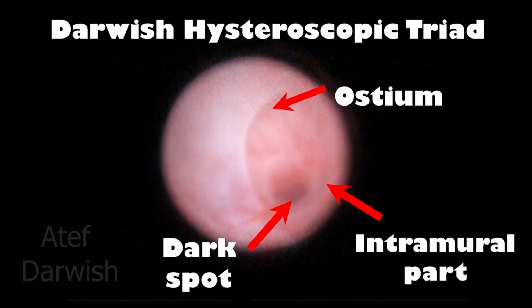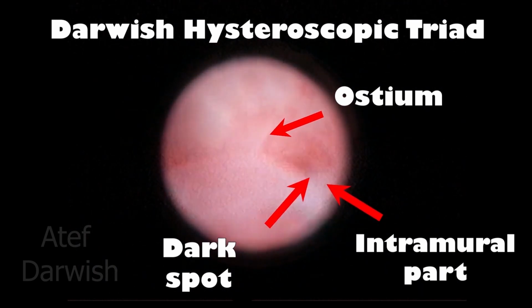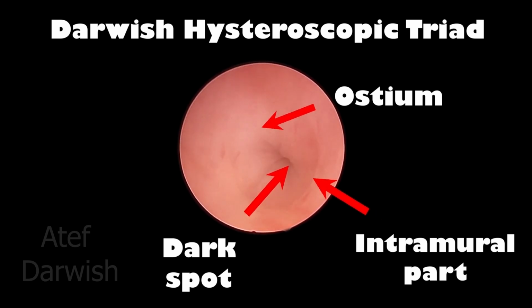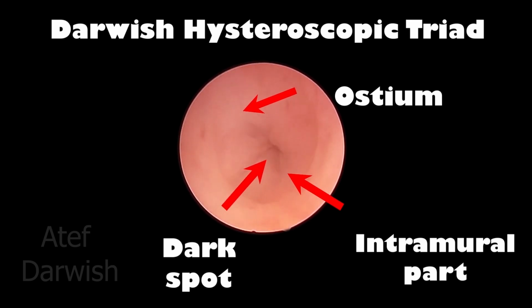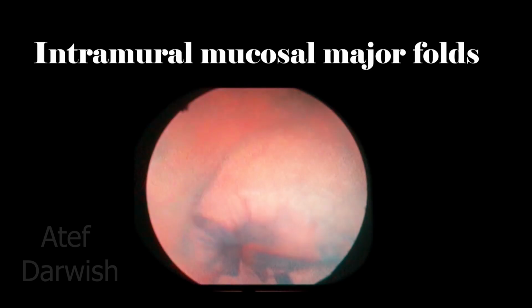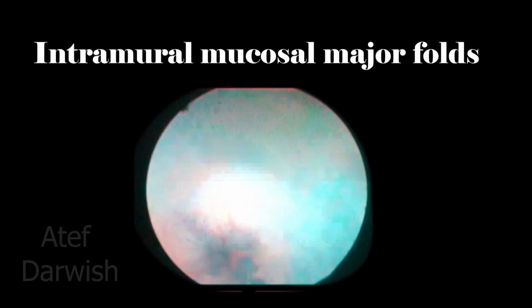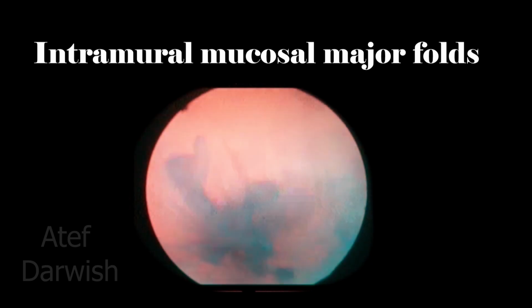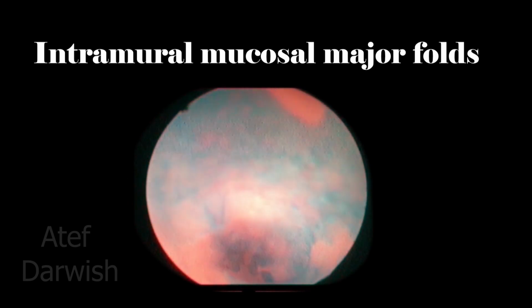As proof that the intramural part of the fallopian tube forms the walls of the cone, in this picture you can see the major folds of the endosalpinx, confirming that the intramural part of the fallopian tube is what's seen as the side walls of the cone of the Darwish triad.